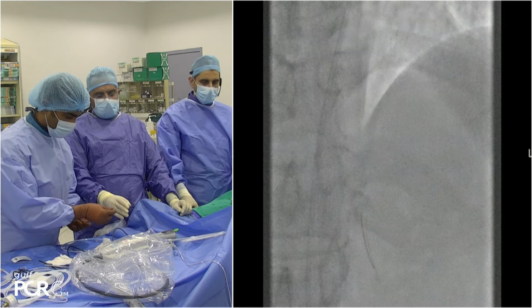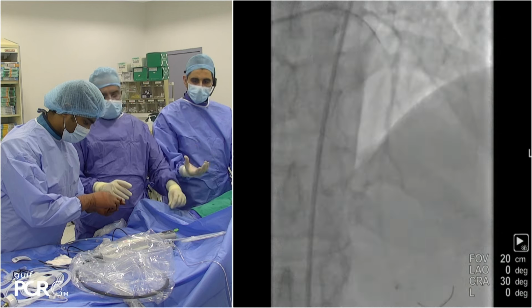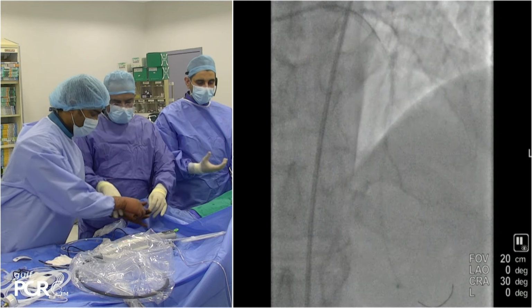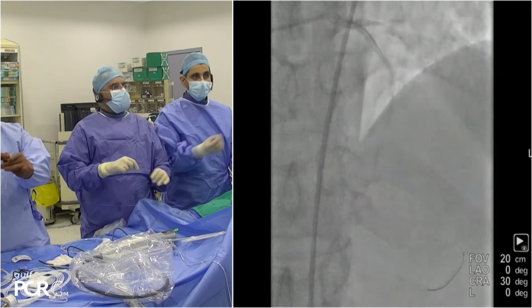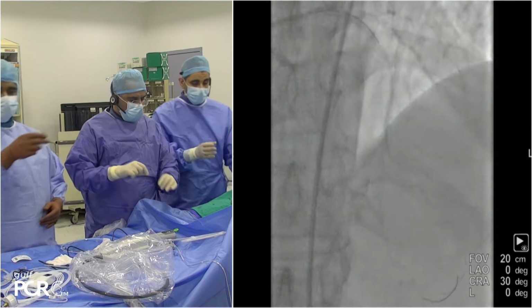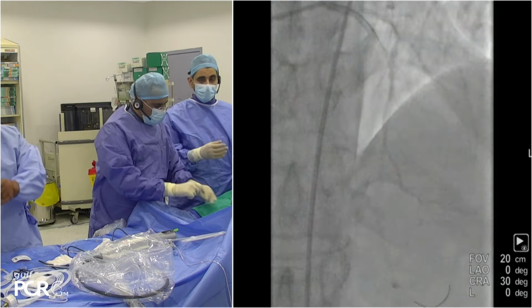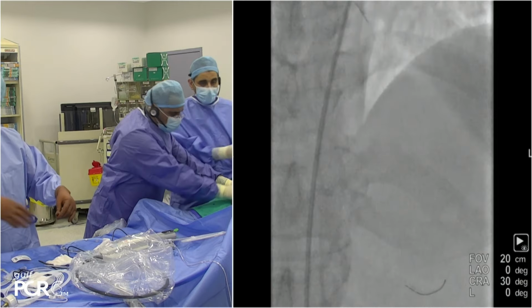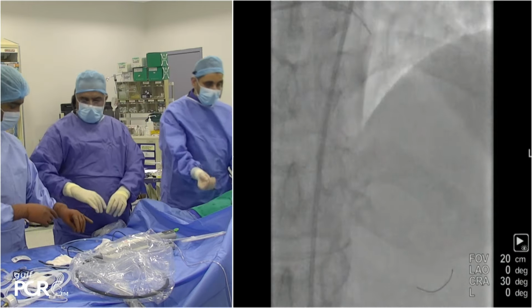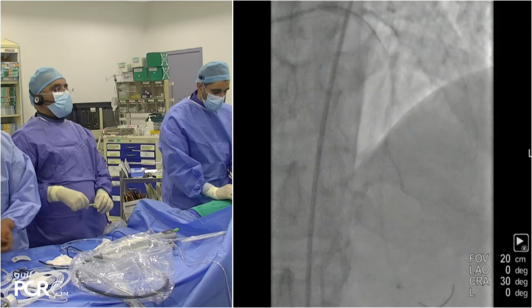Yes, and other things with the orbital, it's one crown size, 1.25, so you don't have to change or upsize it, and it does ablation going in, going out. So in the tortuous vessels that are heavily calcified, where you worry about perforation, one thing you can do is to cross with the orbital and do your ablation retrograde, pulling the device away, so that will minimize the risk of perforation.